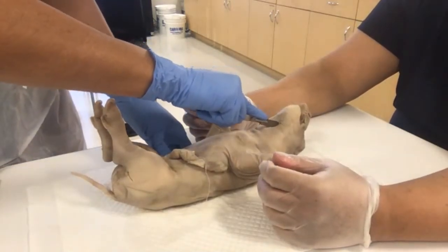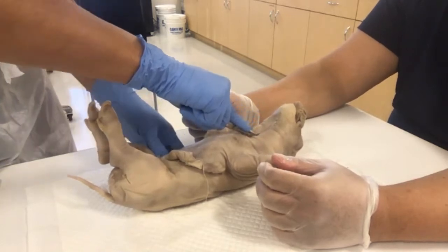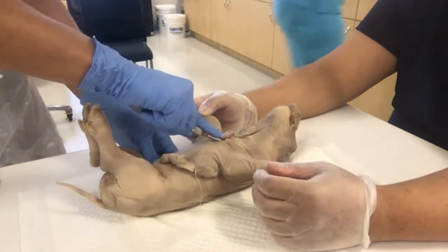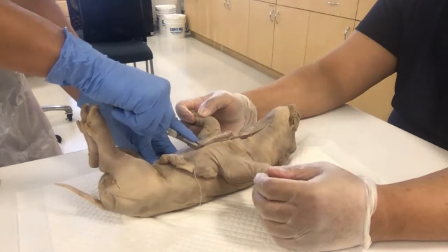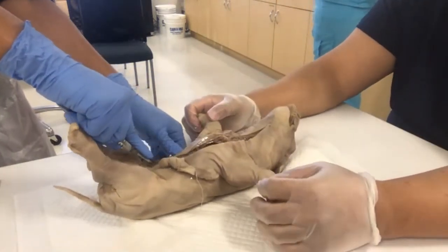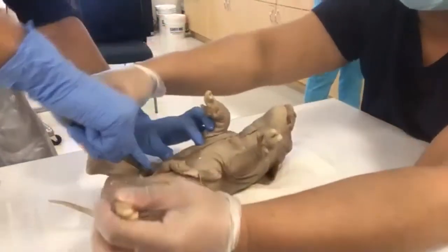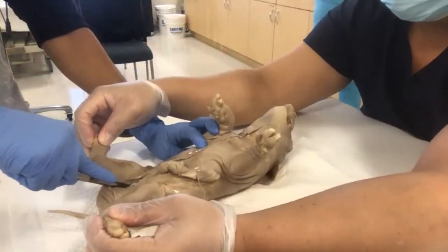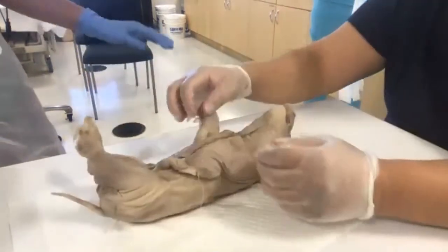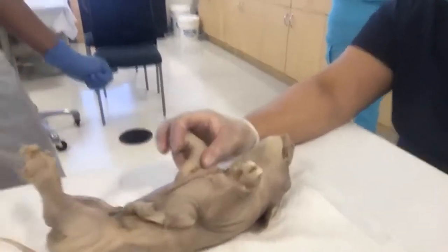Okay, you're fine. Don't be shy. Now, she's cutting just deep. Don't have to be too hard, right? Cutting just deep enough. Okay, now go around, watch your thumb. Let me hold this part. Okay, all the way down. Oh, wish we had a nurse. So, okay, wonderful. Now, before we move further, let's get this closer.